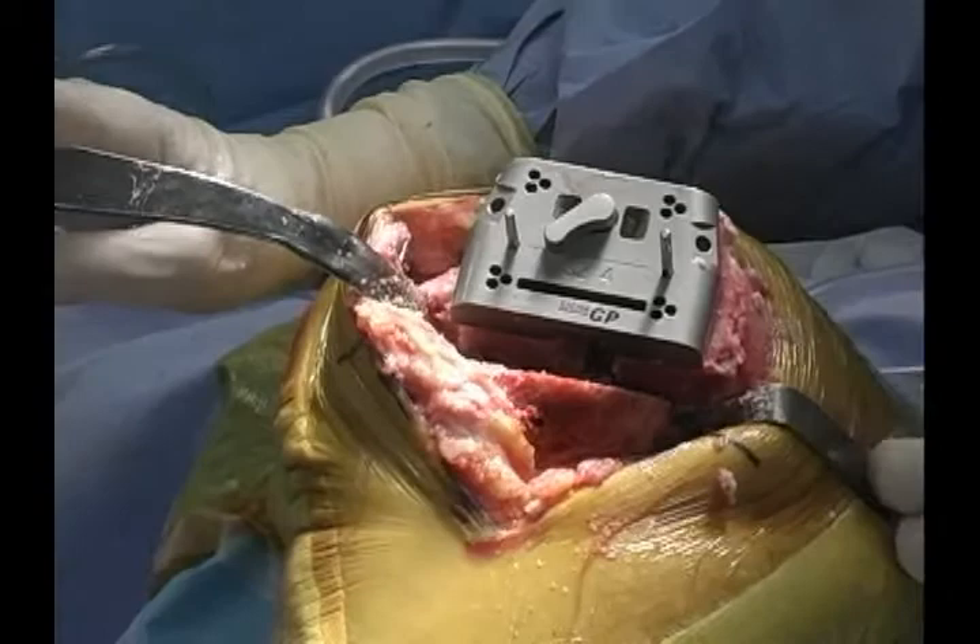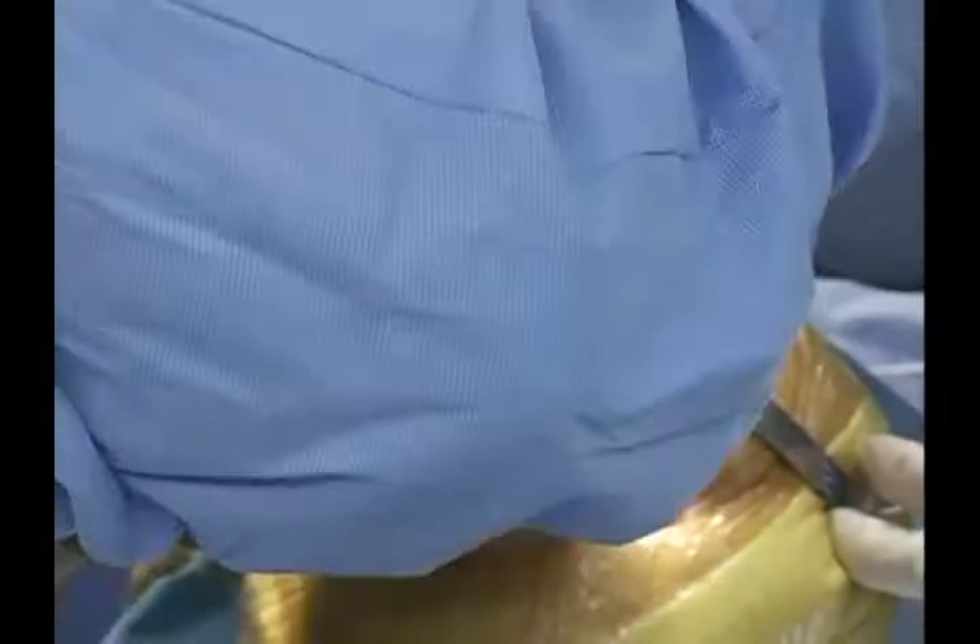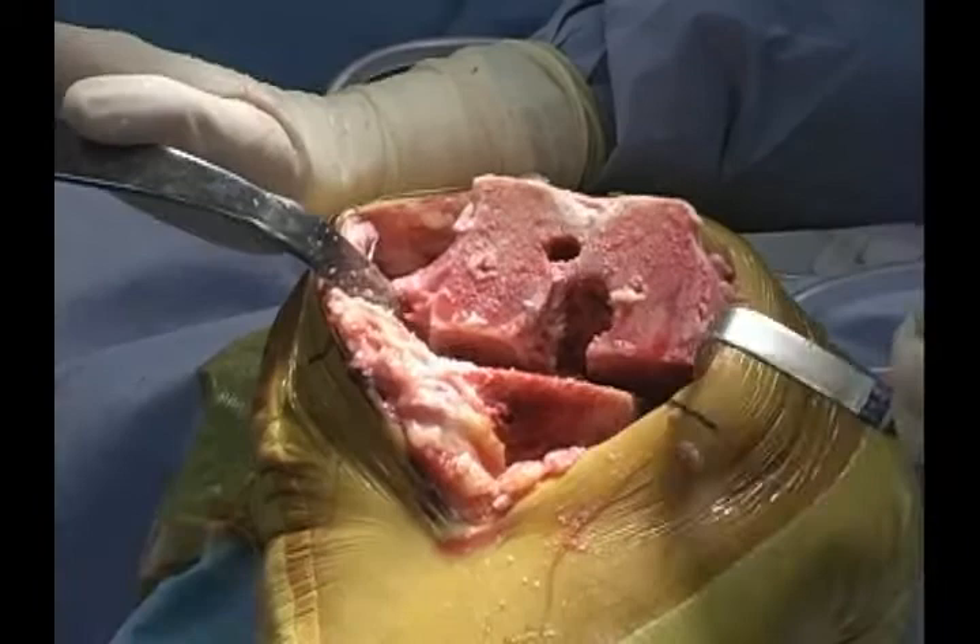Now that we've finished the AP cuts, I'll take my pins out, take my femoral positioning device out, and I'll finish my chamfer cuts with the Toblerone bar, which is the chamfer-only guide.